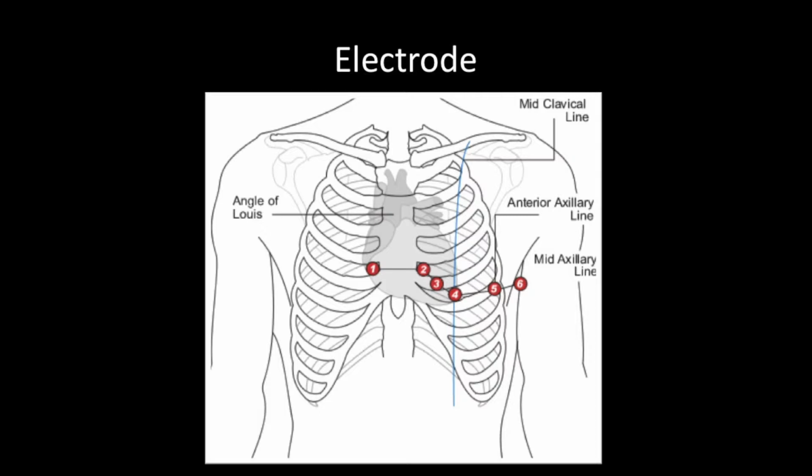If you take the clavicle and you feel your clavicle, right? Go ahead. This is where we actually do something. And then push down. Below there, there should be a space. There's a rib underneath and then a space, just like in this picture. So this space is your 1st intercostal space, 2nd, 3rd, 4th. The other thing you can do is if you drive down on your sternum, at some point you feel some nub or some prominence. If you slide across, there's a 2nd intercostal space.